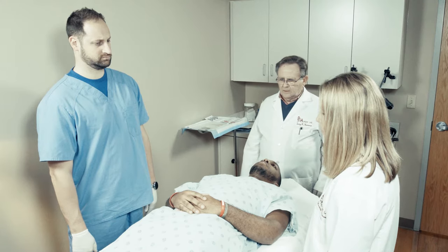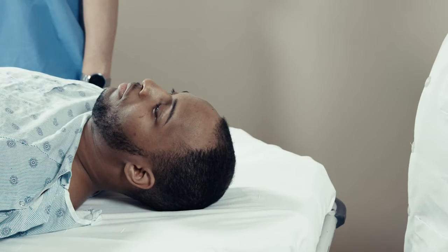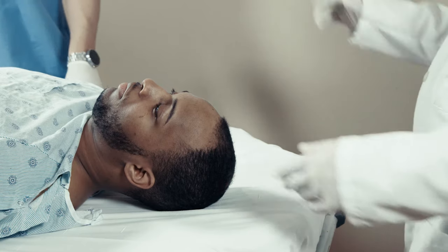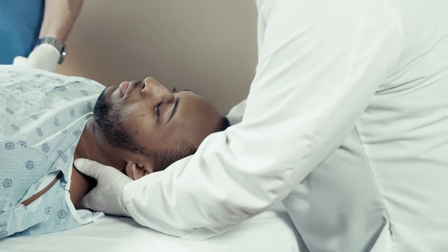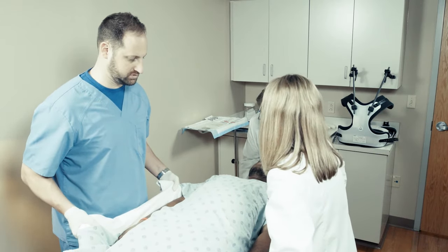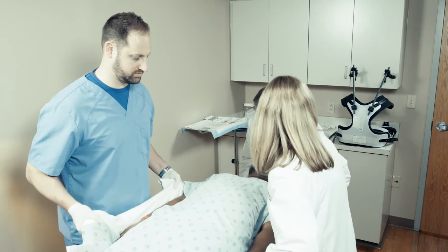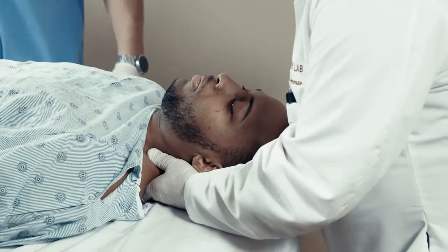Standard precautions regarding cervical spine stability are taken while positioning a patient for HALO application. The patient should remain in the patient bed with the chuck placed underneath. First, lower or remove the headboard. With the physician stabilizing the head and neck, a nurse stands on either side of the patient. Gently lift the patient using the chuck about 6 inches and move the patient to the head of the bed.